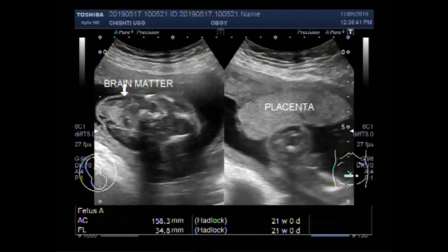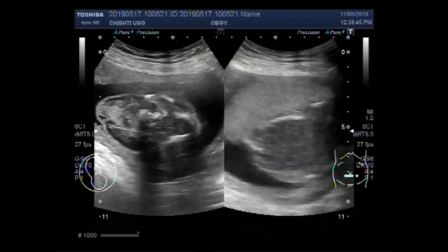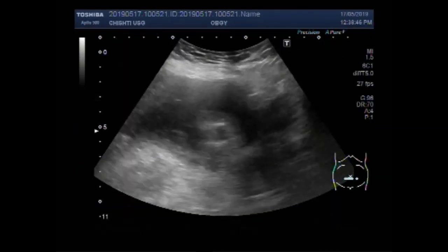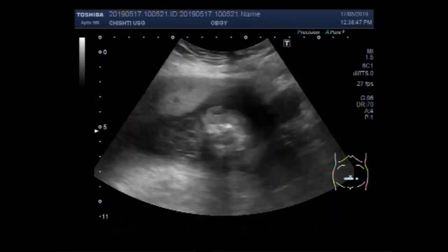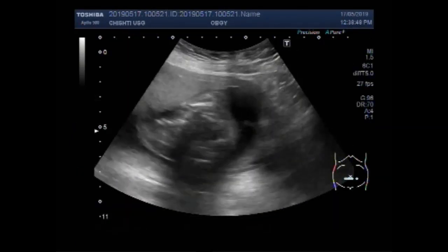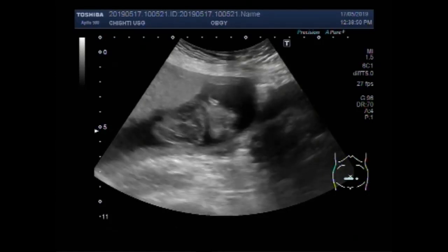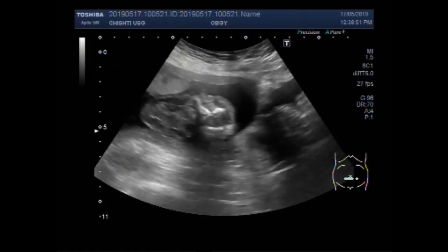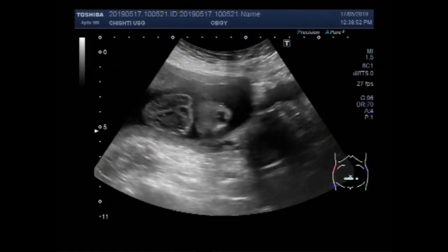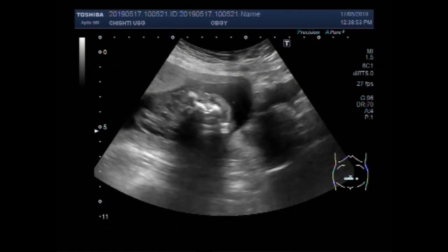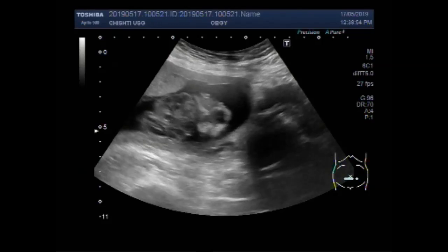Dear viewers, I hope you are all fine. This ultrasound video shows a case of anencephaly — absence of skull bone.